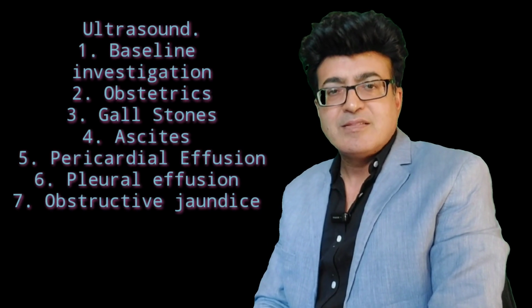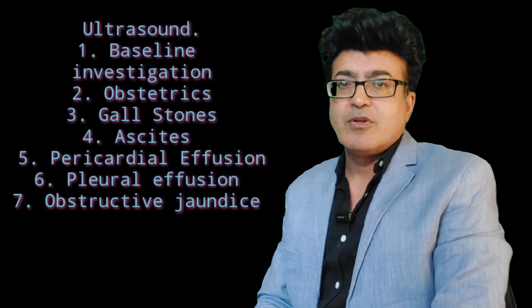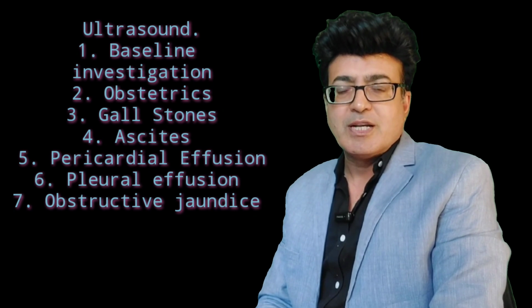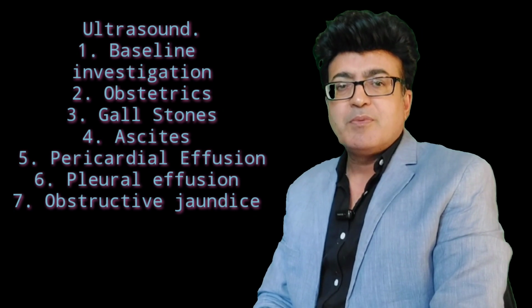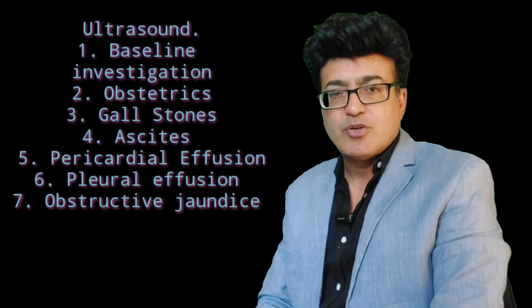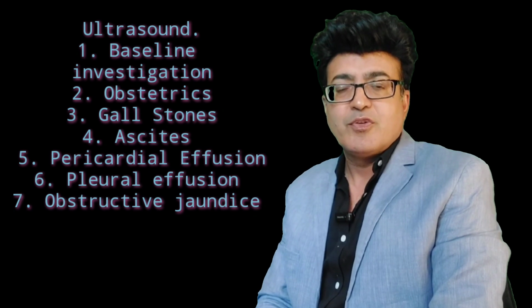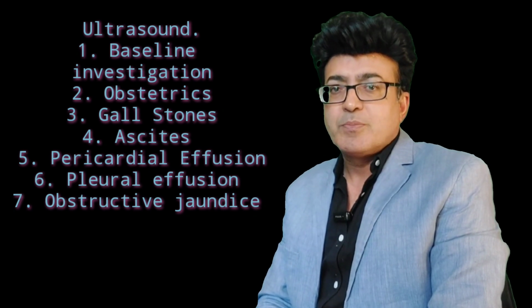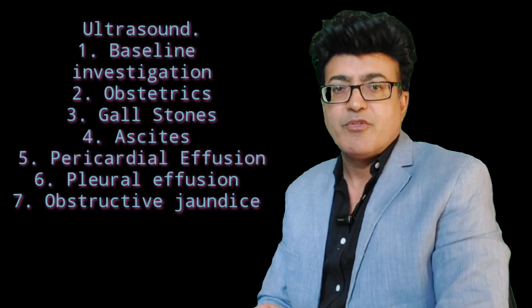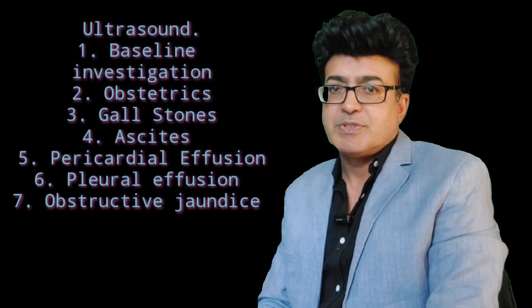Ultrasonography. Ultrasound is the baseline modality, whether you're working in emergency, in the medical ward, in the gynae ward, or in the surgical department. It is the first important baseline modality. But for certain purposes, ultrasound would be considered the investigation of choice, like during the obstetric examination. For obstetric diagnostic procedures, you should depend upon ultrasonography, because ultrasound is one of the reliable methods and the investigation of choice for obstetrics.